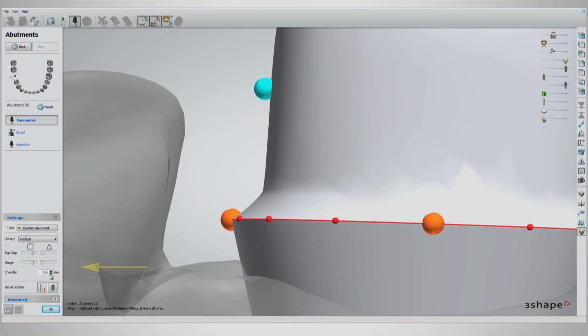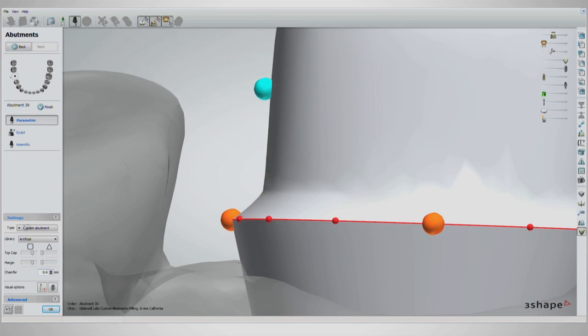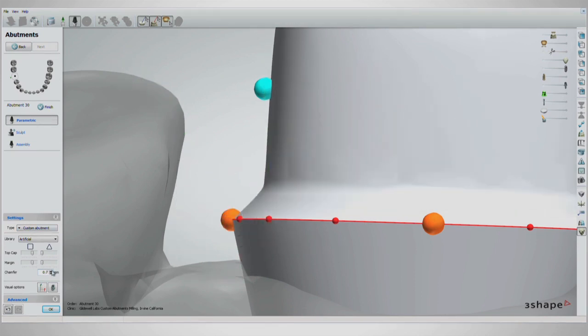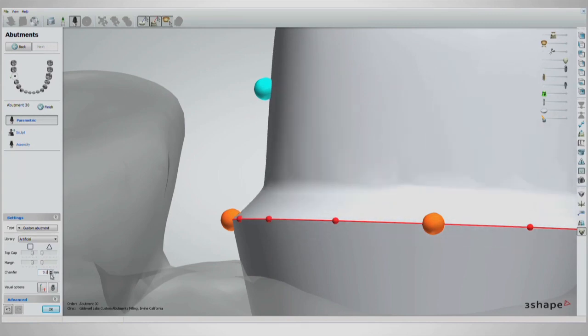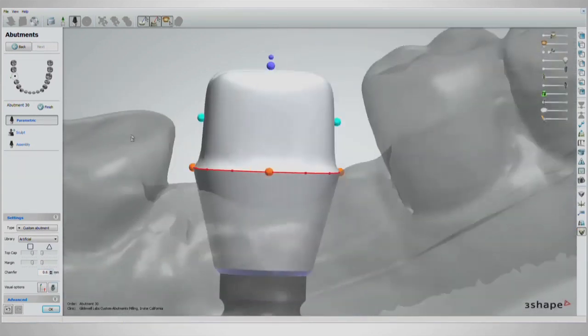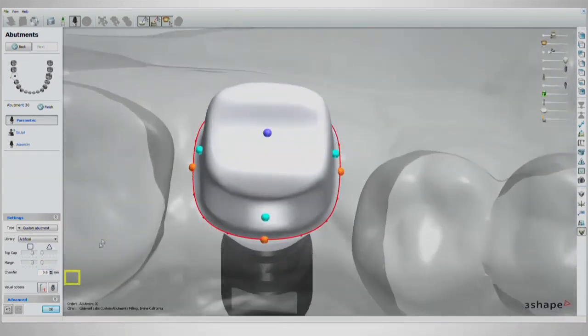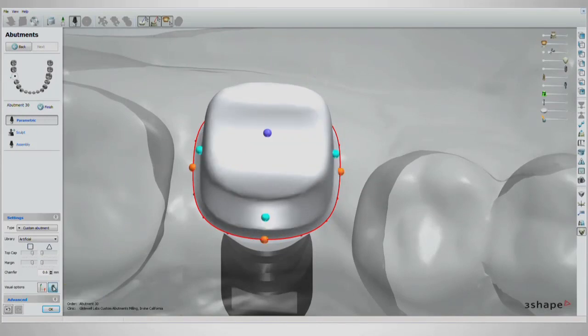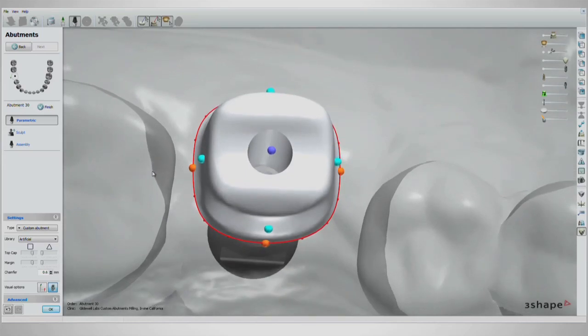Below the sliders is the chamfer size selector. 6 tenths of a millimeter is the standard size we use here at the lab, but it can be changed in real time by clicking up or down on the screen arrow buttons. Below that, we have the screw hole toggle to view the abutment with or without the screw hole. This enables you to get a good idea of what the final abutment would look like.